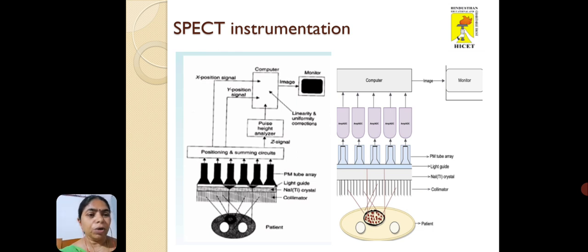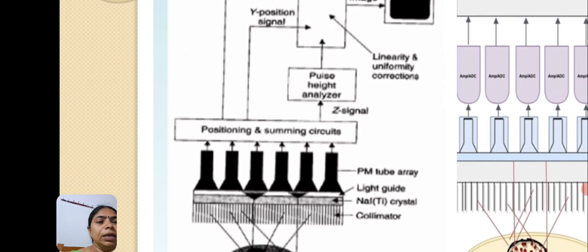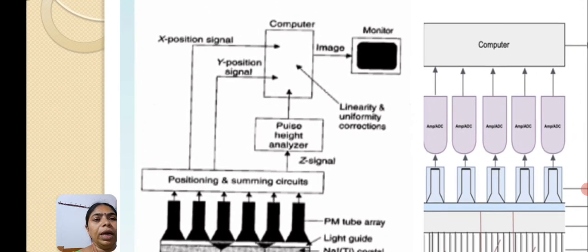Patient: here we give the radio tracer or radioisotopes to the patient. After giving the radio tracer, it will emit the gamma rays. For example, if we want to capture liver images, we can inject the radio tracer in the area of the liver. The tracer will spread over that and emit the gamma rays. The detector consists of the collimator, crystal, photomultiplier tubes and position localization circuitry.